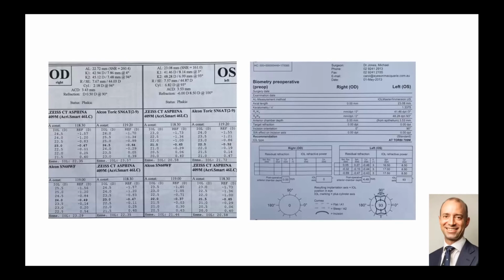So considering her main issue being that she had a high astigmatism, we had to take this further in investigation. Unfortunately, I didn't have a pentacam in rooms at the time, and we performed an IOL master. Looking at that, there was quite a surprise, because you can see that there's a huge steepness in the keratometry. So a large part of the astigmatism was coming from her corneal refractive error rather than from the cataract causing astigmatism. This led to a very difficult decision to make, because the question of correcting, therefore, was not just based on taking out the cataract and the refractive component from that, but also trying to neutralize the corneal astigmatism. Now, at this stage and age, it's very appropriate to consider using a toric lens.